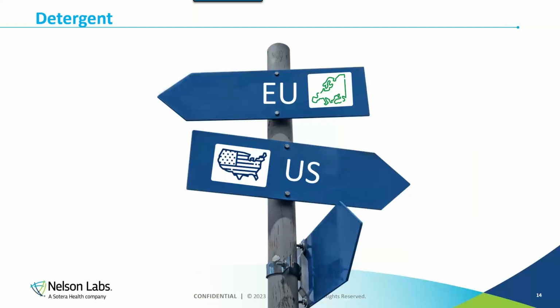Again, what does that mean if you need actually both target markets? Well, we do know that for the US, they're more focused on the detergent being enzymatic than they are on it being neutral pH. And you do have detergents that are enzymatic and that are also slightly alkaline. So you could use a detergent like that to actually cover both of your markets with one detergent.